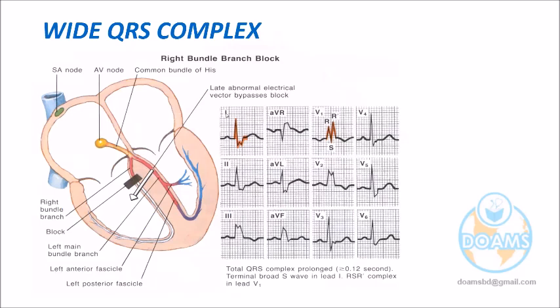Lead 1, which lead, doctor? Left or right? Left heart lead or right heart lead? We must know it, doctor, otherwise you cannot correlate. This one is the left heart lead. For that, R is taller here, naturally. Even lead 3 is also left oriented a little.